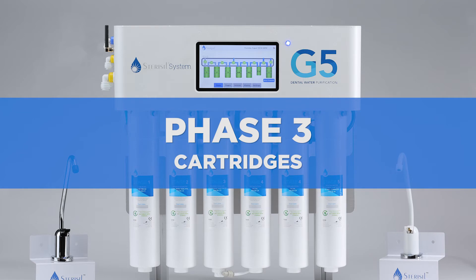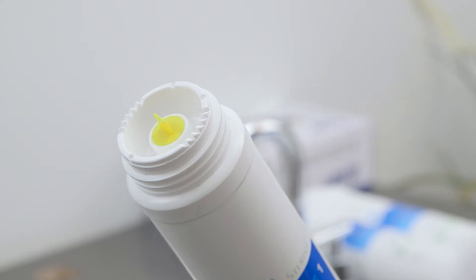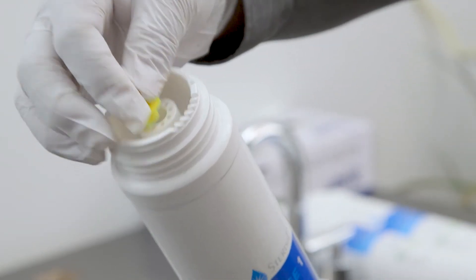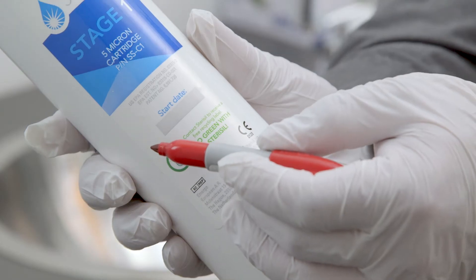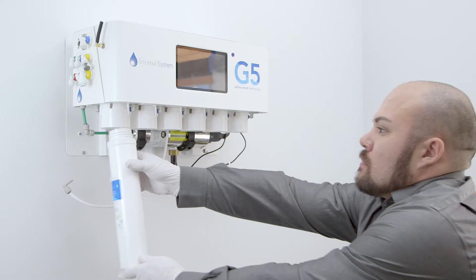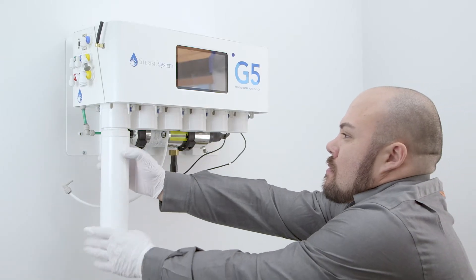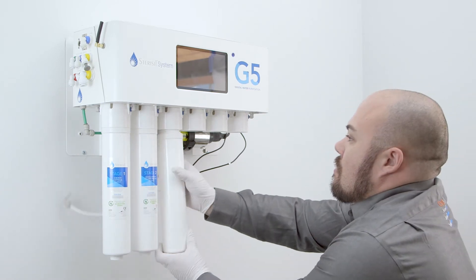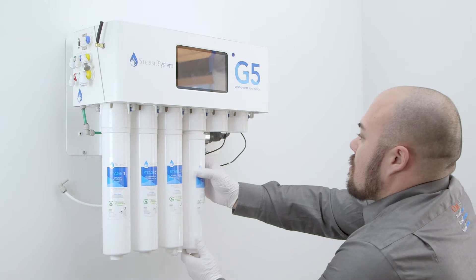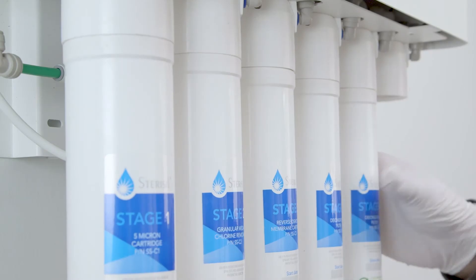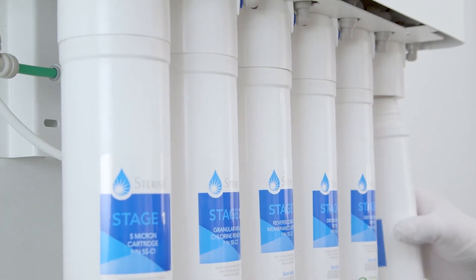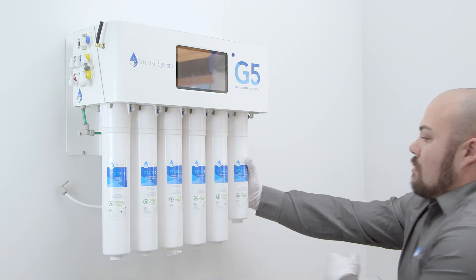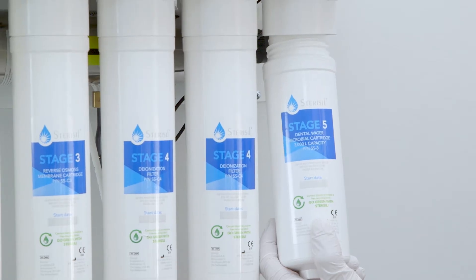Phase three, cartridges. Before you install each cartridge, remove the yellow cap from the top and write the date with permanent marker. Start by inserting the cartridges from left to right, beginning with stage one. Please note there are two stage four cartridges. They'll both be positioned interchangeably in ports four and five. Please note the size of your stage five cartridge will vary depending on its capacity rating.